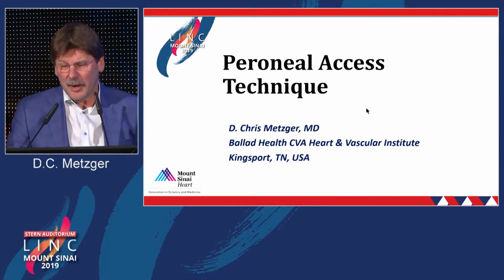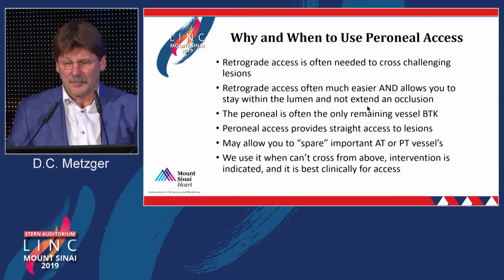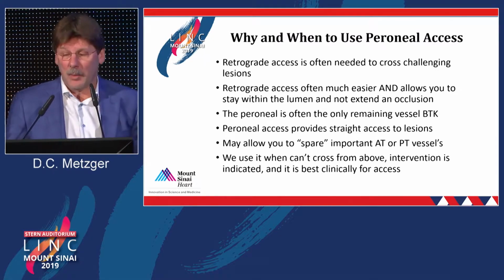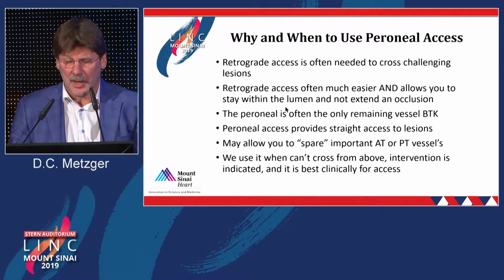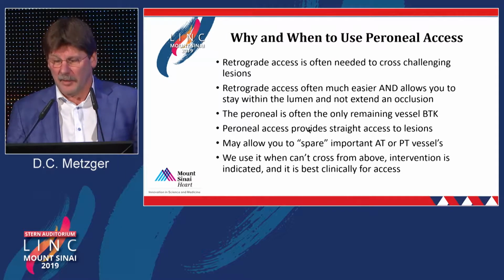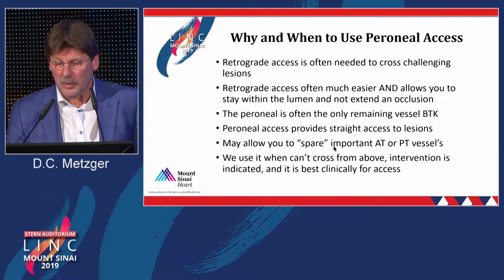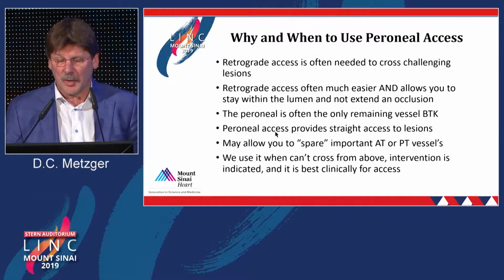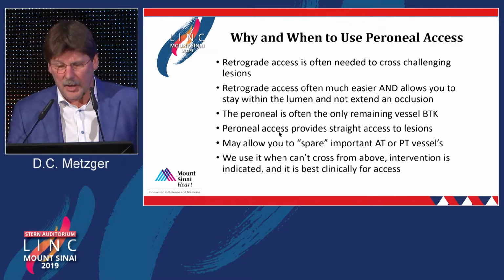All right, so peroneal access technique. Why and when? Well, we've seen many times throughout the conference why we need it and how retrograde access can help us. Why the peroneal? Well, it may be the only vessel that you have left to access, or you may want to spare the AT or PT by going into the peroneal. Furthermore, it gives you straight access, usually, to the retrograde approach.